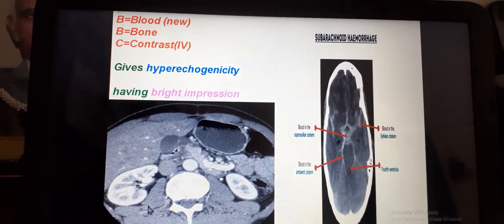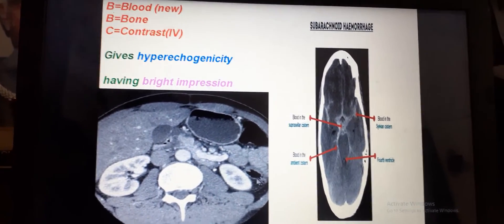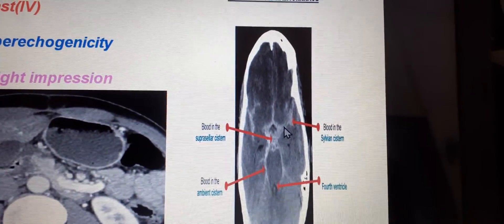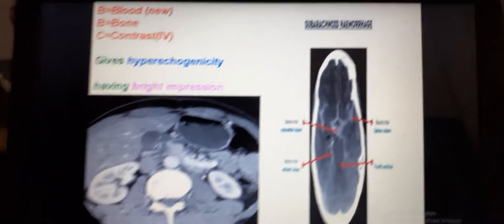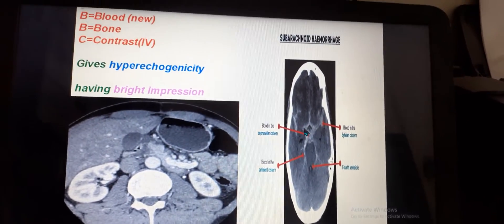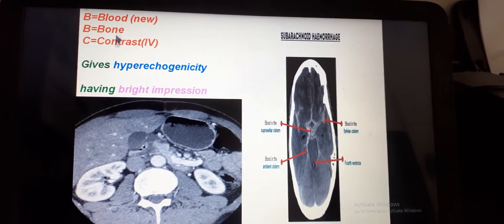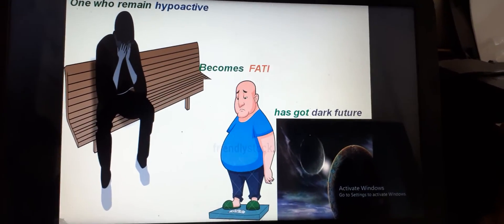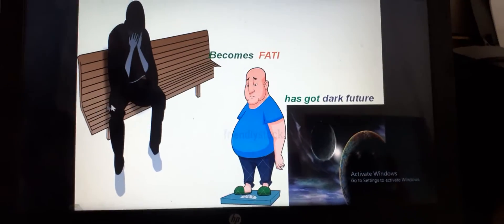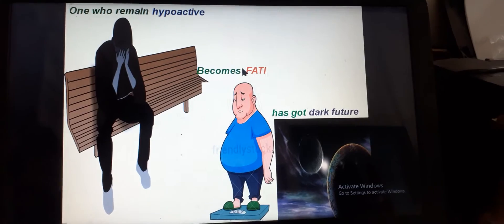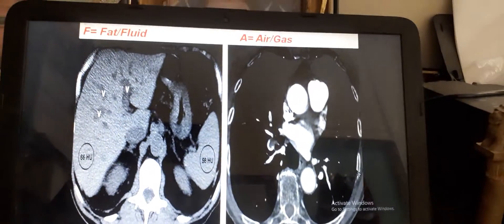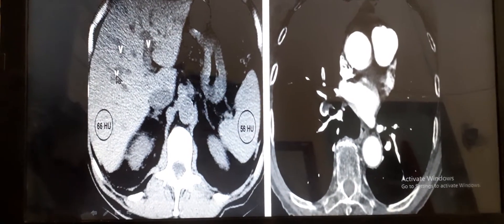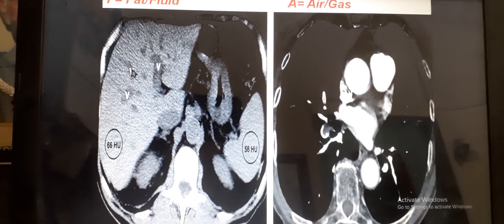Contrast and blood are hyperdense. Here you can see a case of subarachnoid hemorrhage — the hemorrhagic blood has a bright impression, showing hyperdensity. BBC: blood, bone, and IV contrast. For hypodense structures, those who remain hypoactive become fatty and have a dark future. The mnemonic is 'fatty' — F for fat. The image shows fatty infiltration of liver, which has a dark impression.